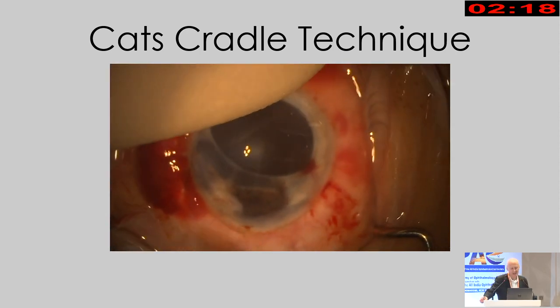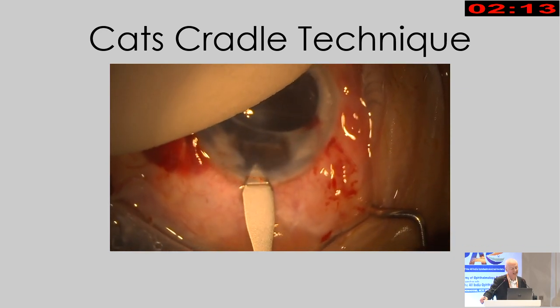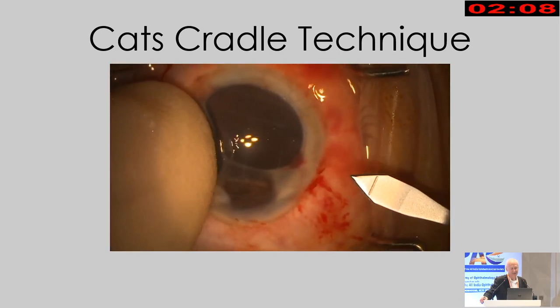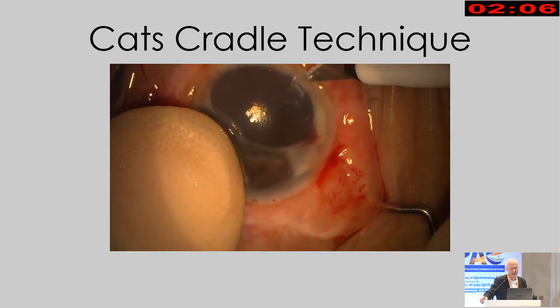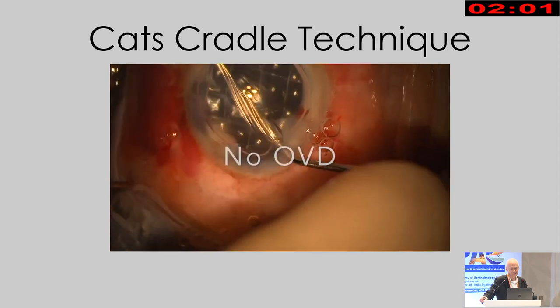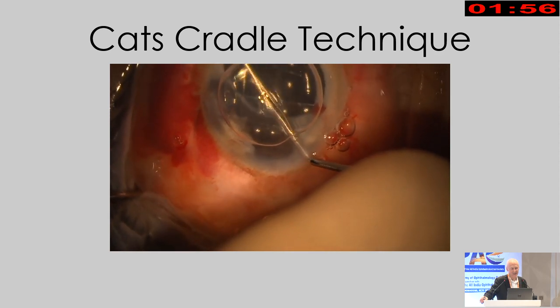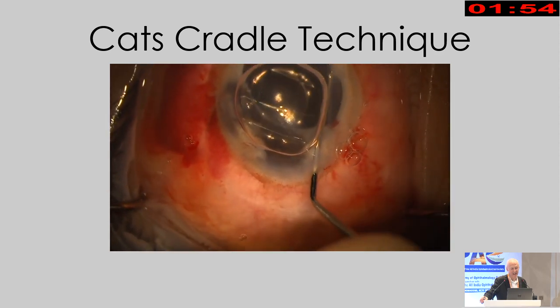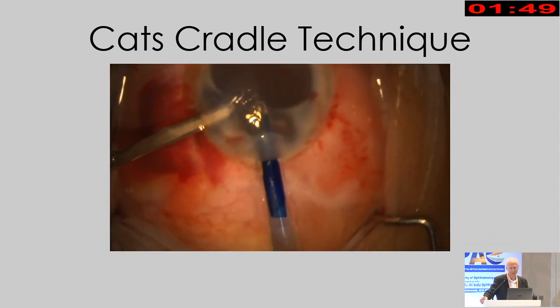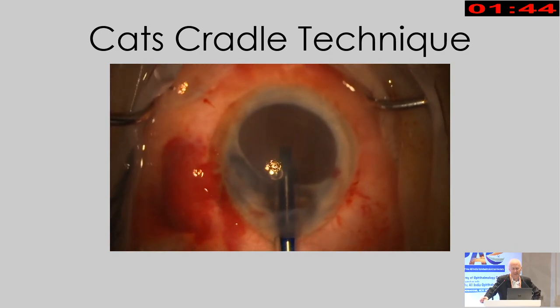And then your incisions, just make sure you stay anterior to your safety net and try not to cut the suture. Easy enough to do though. And then you have to do the rhexis over air in a unicameral eye. And you can see the suture pretty clearly there. And so the rhexis is done over air. Always difficult to contain the air bubble in the AC, so again you can use an AC maintainer and air infusion if you want to. But this is much easier than we thought it was going to be.